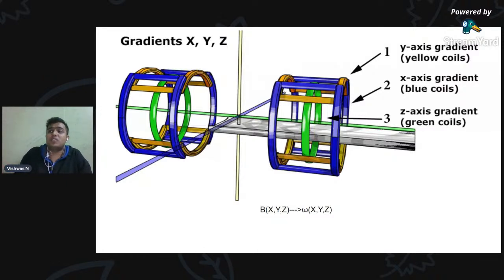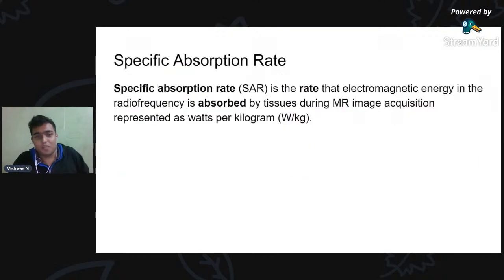There is something called DICOM images, Digital Imaging and Communications in Medicine. When you think of such formats, it's a huge chunk of data which is being aggregated and thrown to you. So lots and lots of frames, lots and lots of processing.